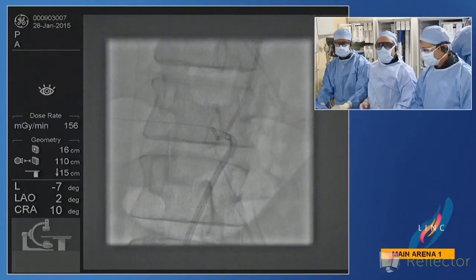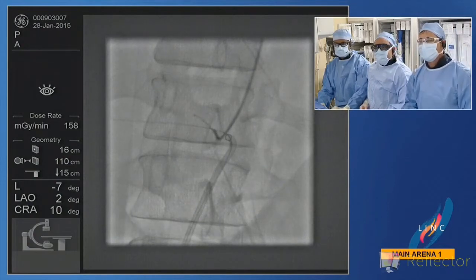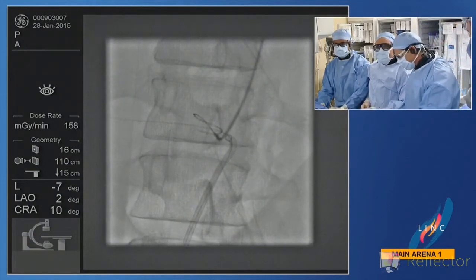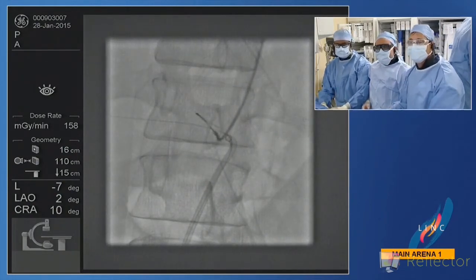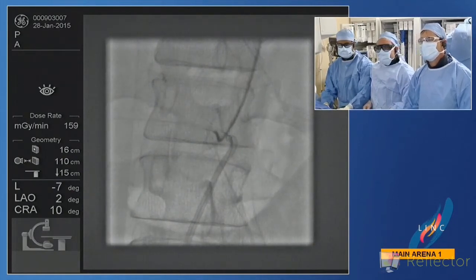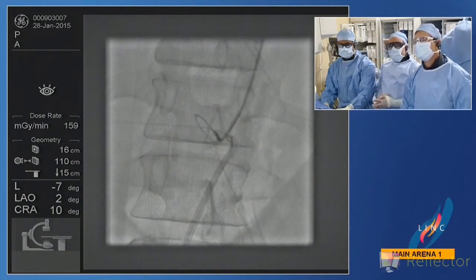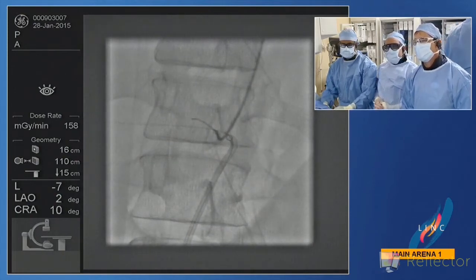As you were watching, I brought out a glide catheter. Again, the Morph is working nicely for us here. I think we have a good secure guide position. Once I have the glide cath out, I have a 260 018 Platinum Plus wire. Is that a 6 French Morph or an 8 French? 6 French Morph. That'll limit your Viabahn to what, a 7? It'll limit our Viabahn to a 7. Yeah, and it's an 018 system.